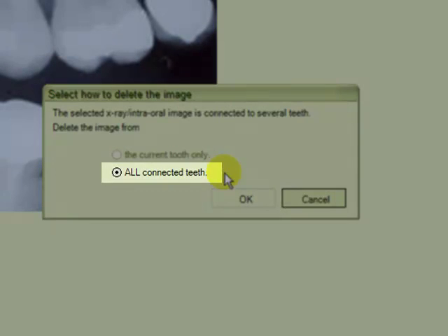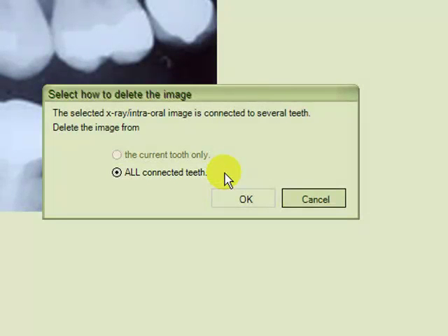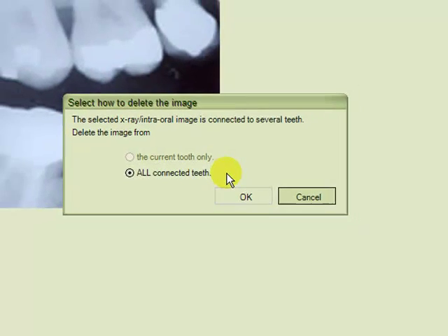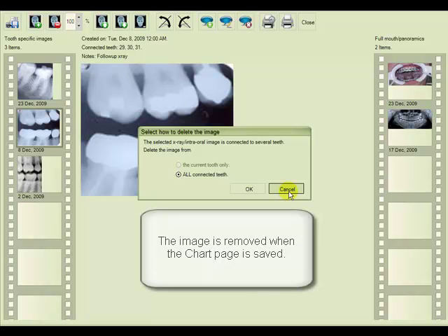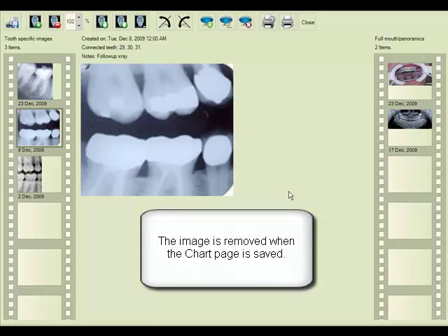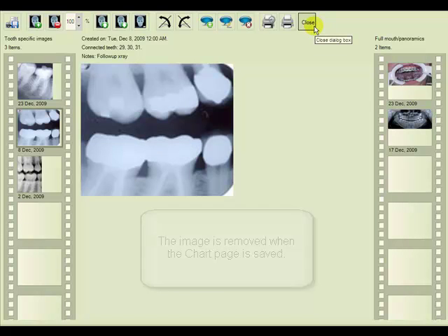It is important to note that deleting the image here will delete the image file completely from the Fields of Code database. The only way to recover an image deleted this way would be if you still had a copy of the image on your hard drive. So we're going to cancel this.